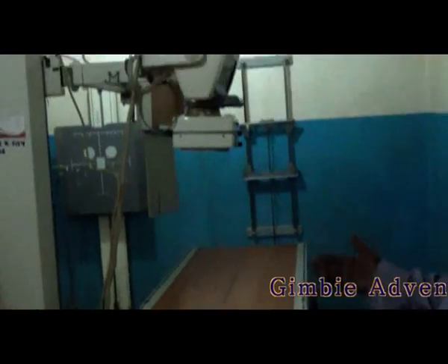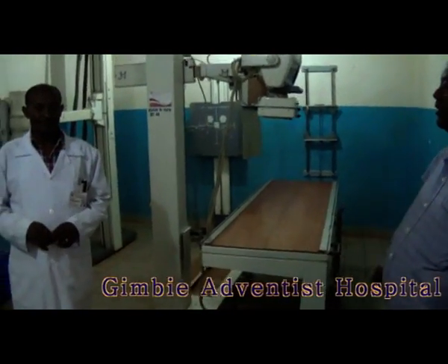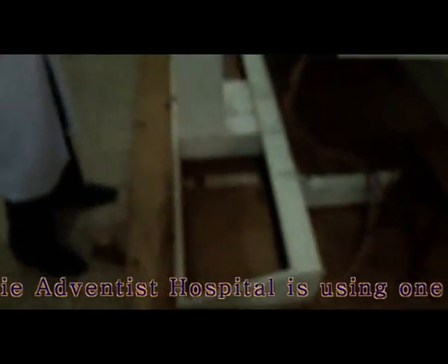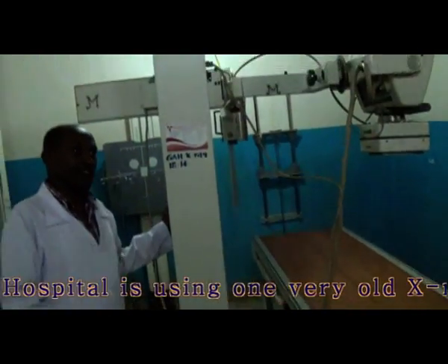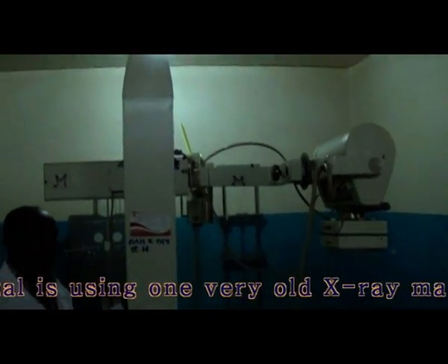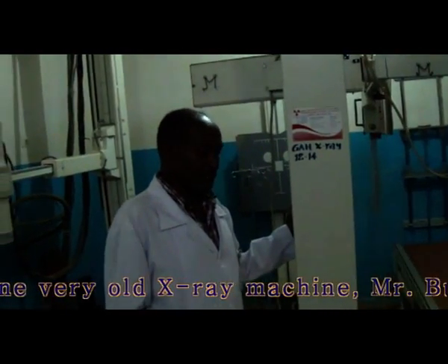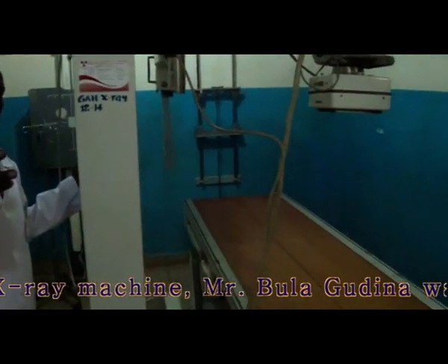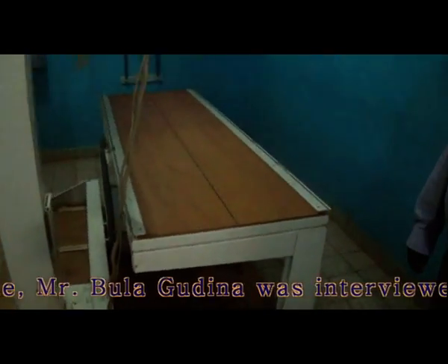Guta. Would you tell us the condition of the X-ray machine that you are using here? Yeah, I can tell you. The X-ray machine that we are using is a very old machine. We got it from Germany as a donation, and it served there for a long time for the army.